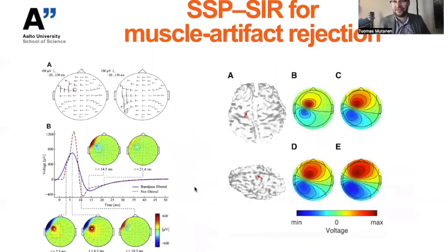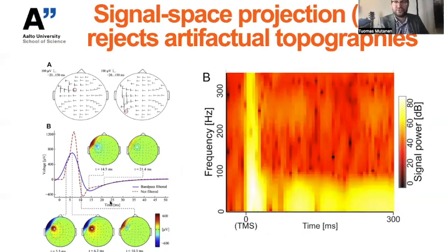But we also know that if we use our forward modeling techniques and try to model the cortical signals that we would expect from, for instance, the primary motor cortex, even with different types of conductivities and what have you, we can see that these topographies would be rather smeared and spread out, very different from what we observe when we have a big muscle artifact. So the question is then, how could we remove those muscle artifact responses?